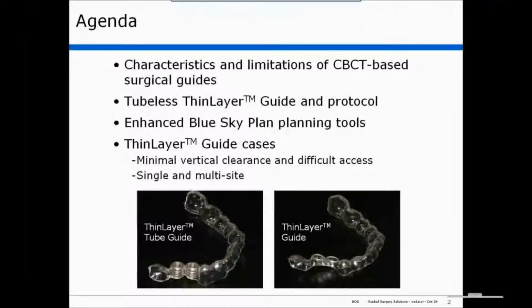I use tube guides on many cases. In response to my experiences with tube guides, I developed the Tubeless ThinLayer guide to address the limitations of tube guides, which we will discuss. We conducted a survey of 12,000 implant dentists in the U.S., and the results of this survey validated my impressions. Today, I would like to discuss some of the issues associated with guided surgery, review our survey results, and introduce a novel 3D-based drill guide system.